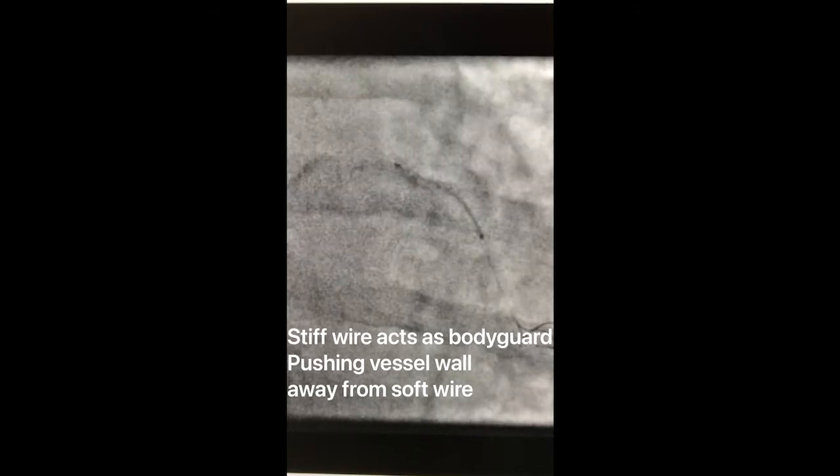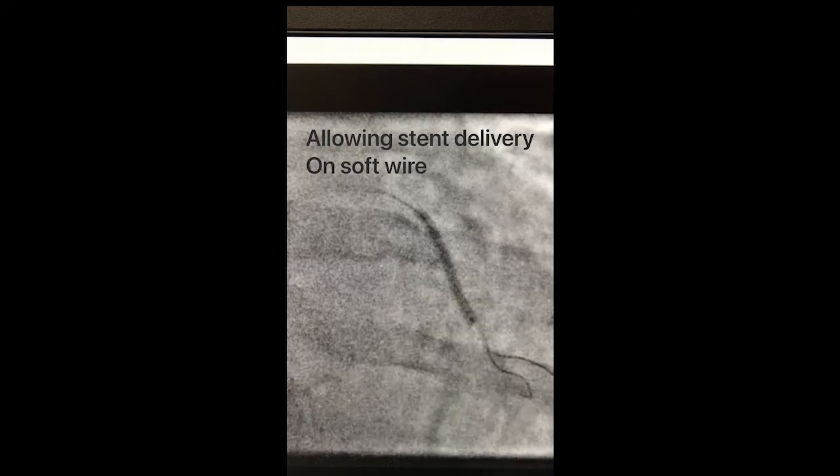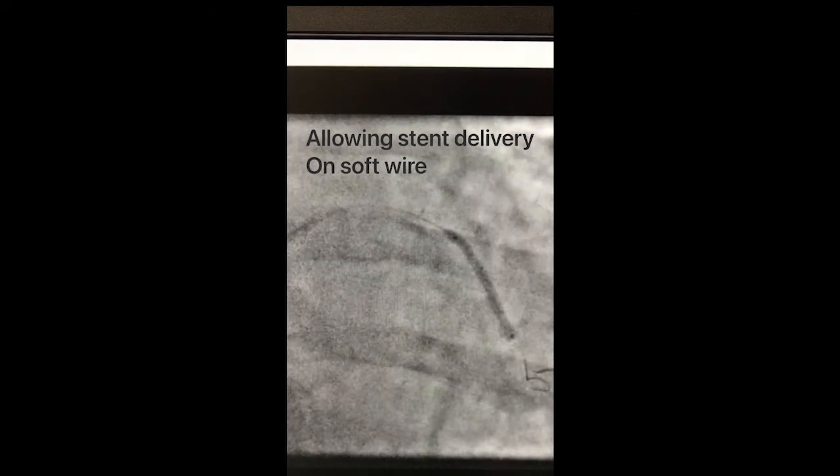A Run Through wire was then used in parallel to deliver the stent, as you see in this film.